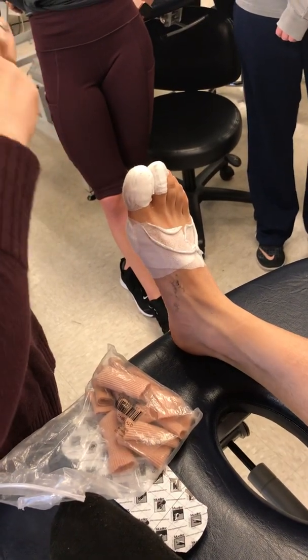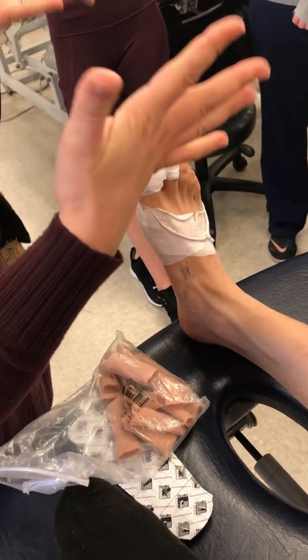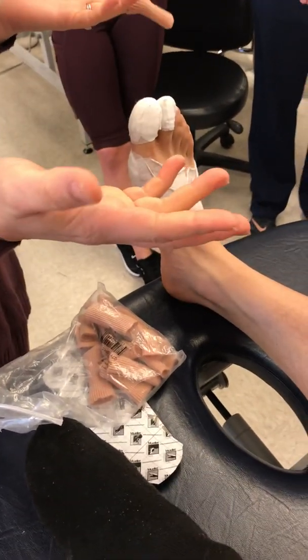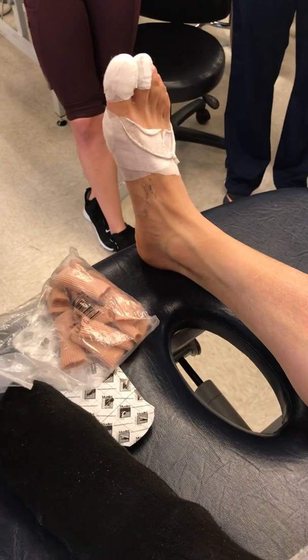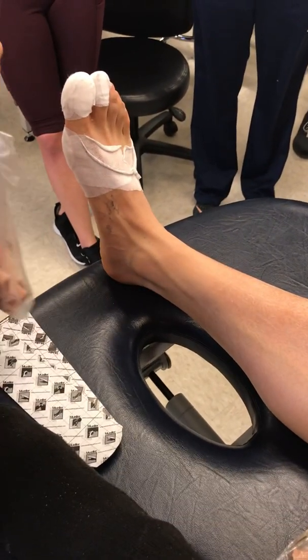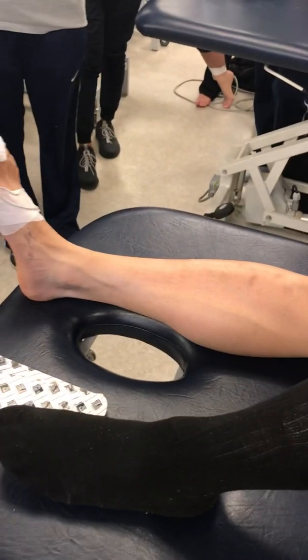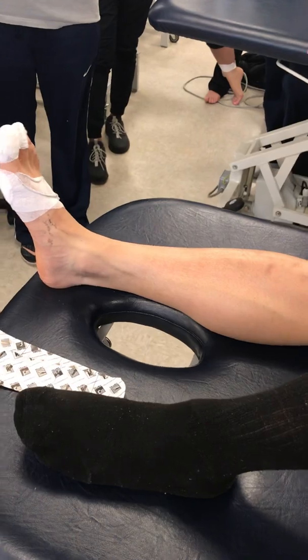You want to stretch the toe cap, have them slide it on, and then that is in place of their tape. If they don't like taping, don't want to tape, and they feel this is easier, and you're not around, you can just have them buy some toe caps, okay? So that's going to be here for you. We'll keep them just so people who haven't felt a toe cap can.